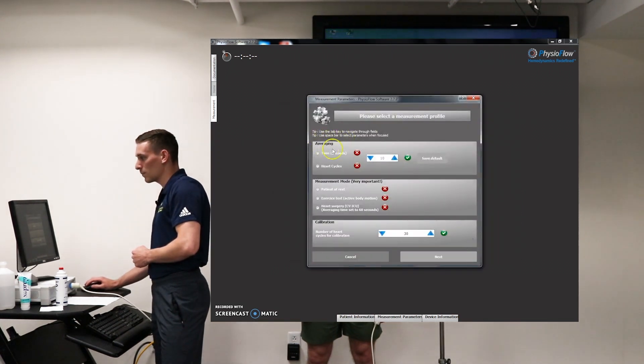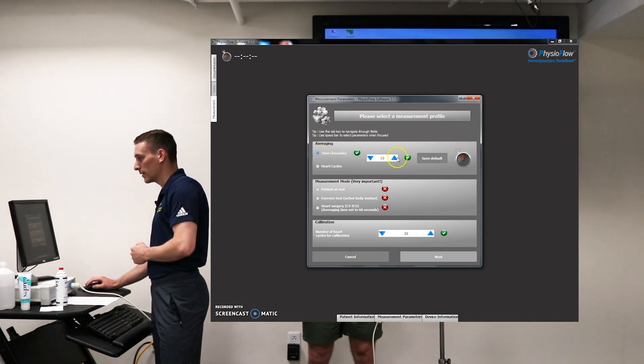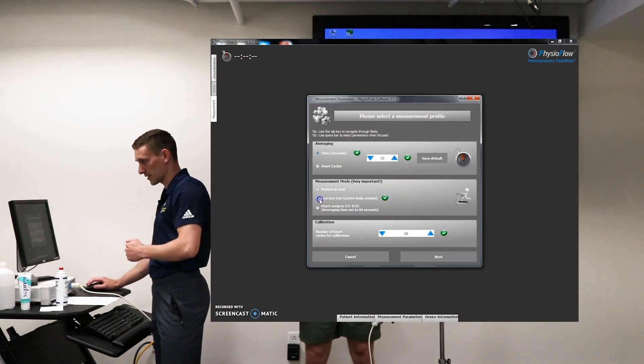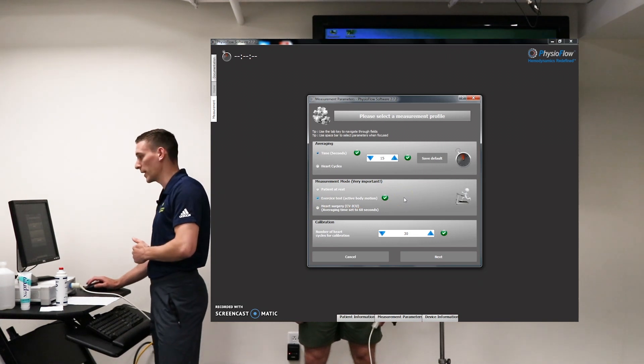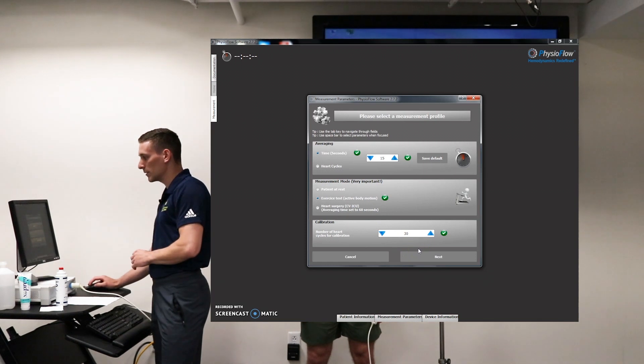This pop-up concerns the averaging and the measurement mode. For averaging, select 'time' and increase that to 15 seconds. For the measurement mode, hit 'exercise test' because we will be exercising. The calibration down here you don't have to touch — leave that at 30 — and go ahead and hit next.